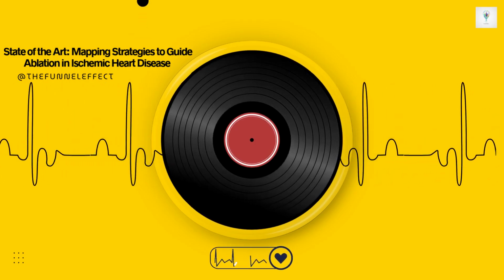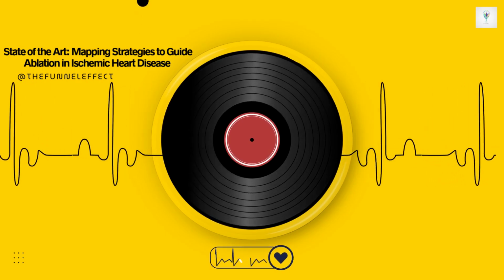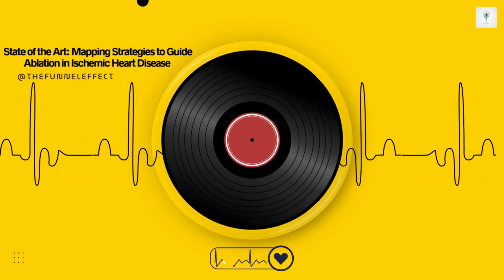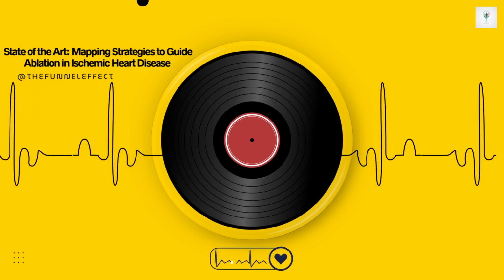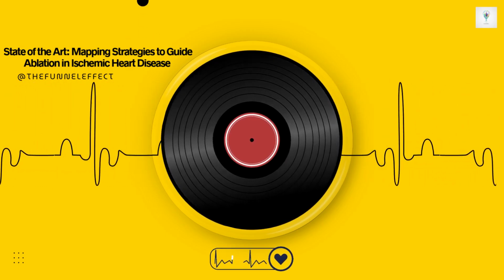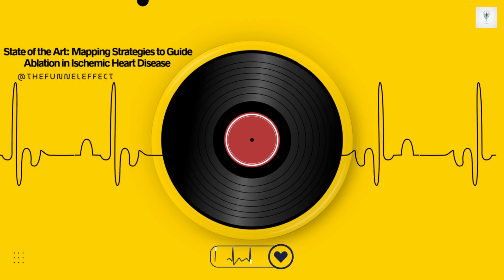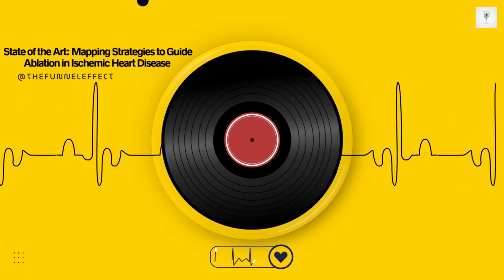It's useful because the heart's normal rhythm, sinus rhythm, can actually hide the true electrical behavior within the scar. Imagine those surviving muscle bundles within the scar. In sinus rhythm, they might all get activated more or less together, but they might have subtle differences in how quickly they conduct or how long they take to recover their refractory periods. By introducing a premature stimulus, an early beat, often called an S2, or by pacing rapidly, we stress the system. We exploit those subtle differences.